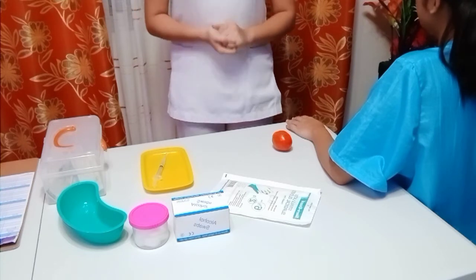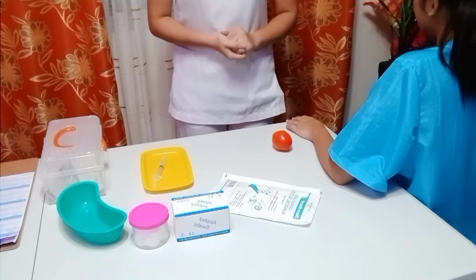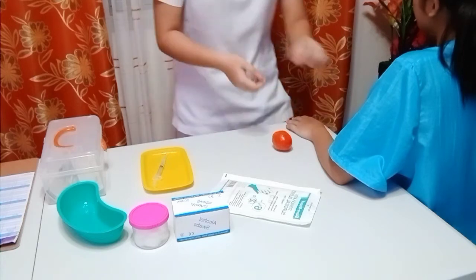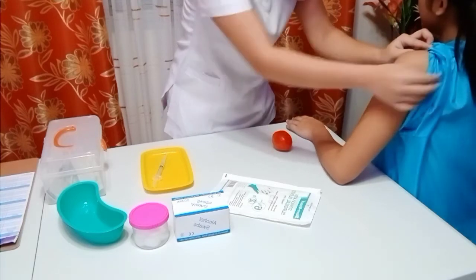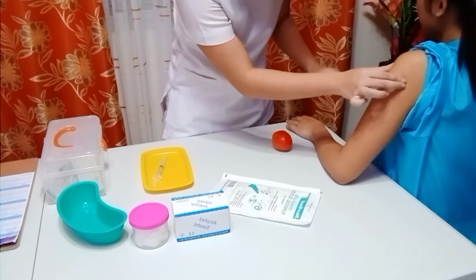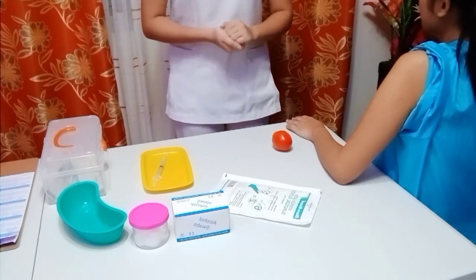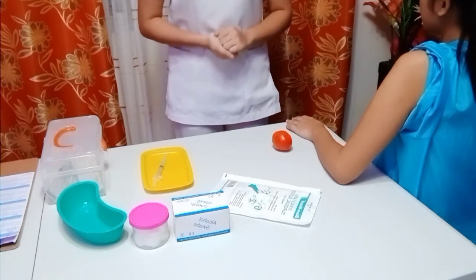Next is to select a site free of skin lesions, tenderness, swelling, or localized inflammation, and one that has not been frequently used. Ma'am, ahong isa ka ang bukton sa imong sanina, ma'am, ha? Nodules or lumps may indicate a previous injection site where absorption was inadequate.